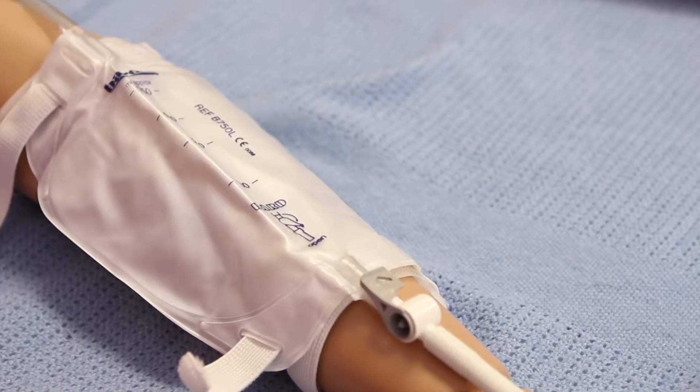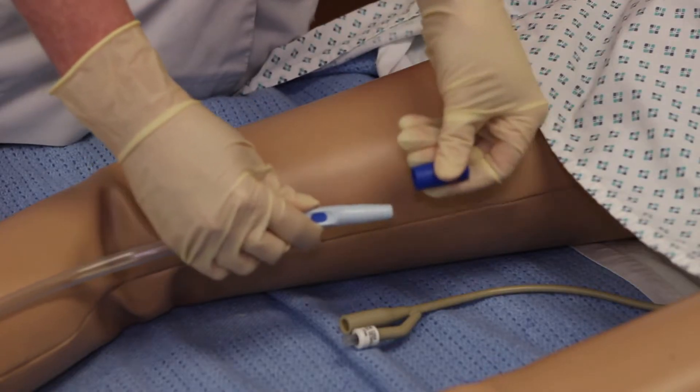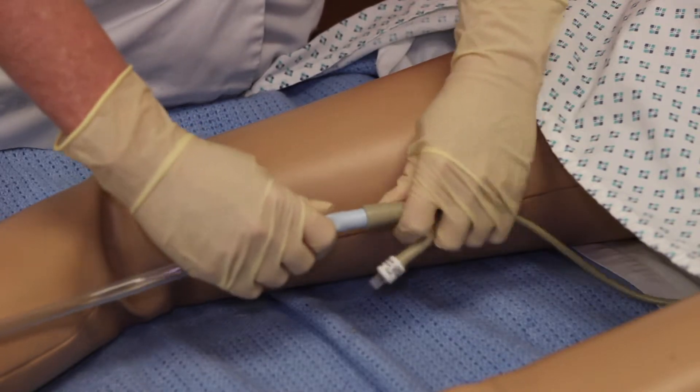A leg bag is connected to the urinary catheter during the day to allow you to mobilise freely and can be used underneath clothing discreetly. To connect the leg bag, remove the cap ensuring you do not touch the top of the tube — this will reduce the risk of introducing infection.